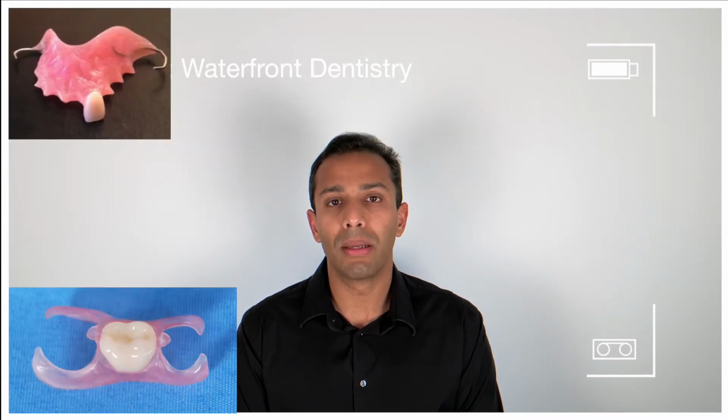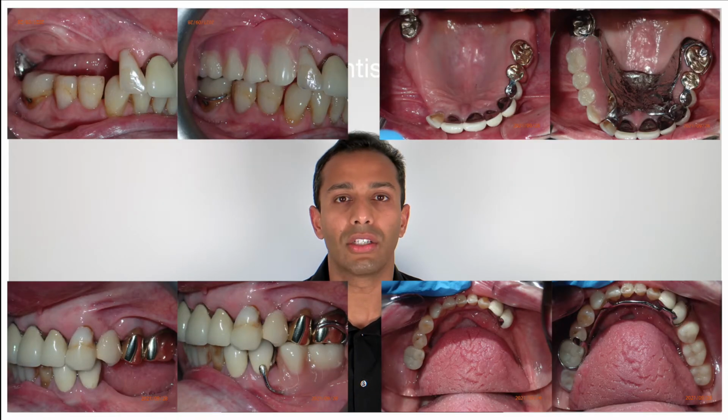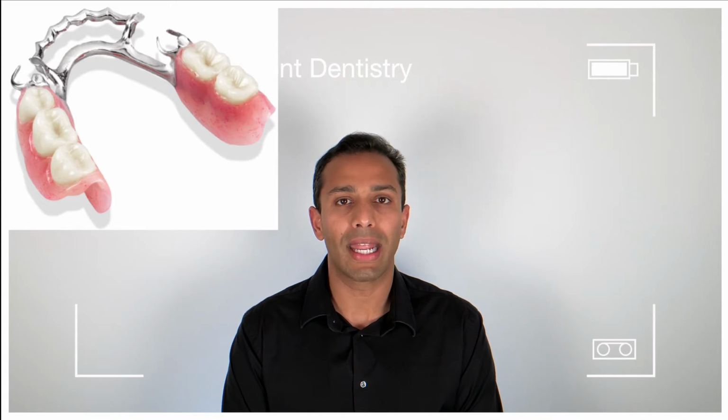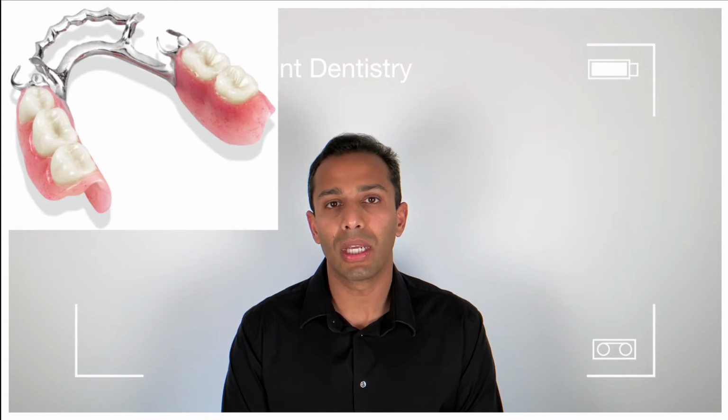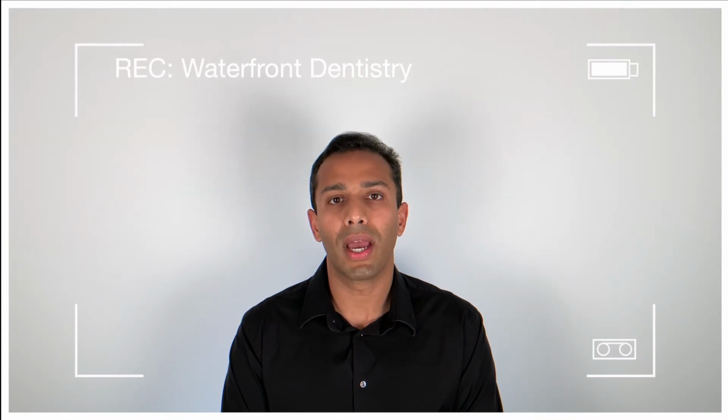Now, removable can have multiple options like a removable partial denture, a flipper, which is the most preliminary removable partial denture, and then you have a cast partial denture, which is a little bit more fixed. It consists of acrylic, which is plastic, and also metal, which can clamp and hold on to parts of your teeth, and has a few more components like your major connector, your minor connector, your retentive terminal tips, and of course your guide planes. Now, these are all a little more complicated, but in the photos in the background, you can actually see what I'm talking about.